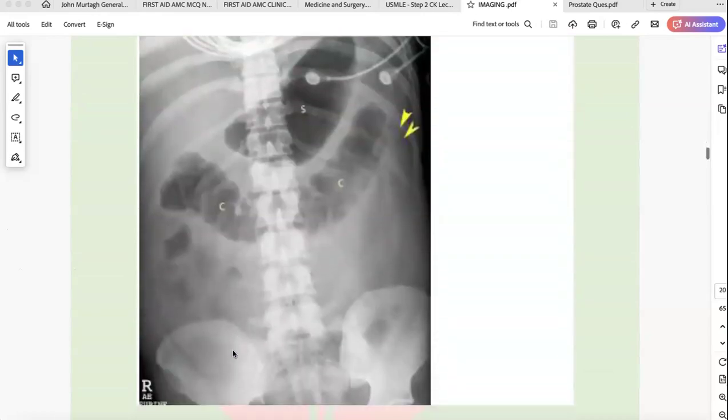Sometimes, along with the CT scan, if you have done an X-ray, you know how to diagnose small and large bowel obstruction. We discussed that in the class. If you get a colon cutoff sign, that's also one of the very important findings to think of an obstruction by a cancer. You can see here that's a transverse colon. After this transverse colon, there is no gas shadow. So that means there must be some kind of obstructing lesion here. That's why the gas is not passing after that. So this is also a possibility that it could be a cancer, especially a sigmoid or descending colon cancer.